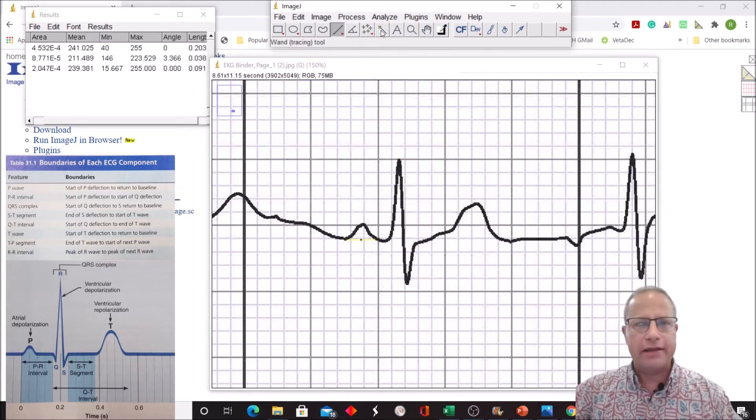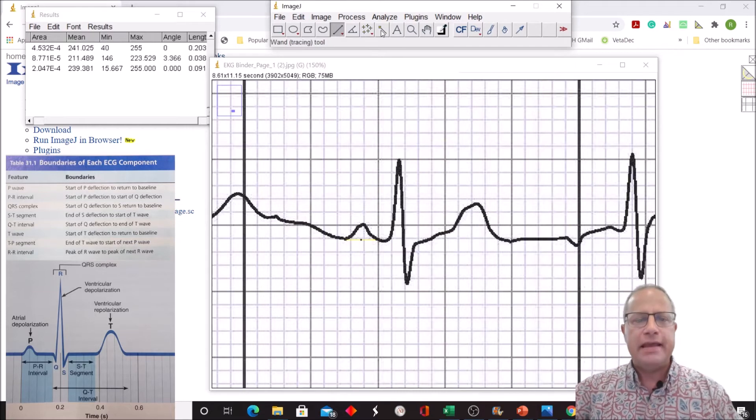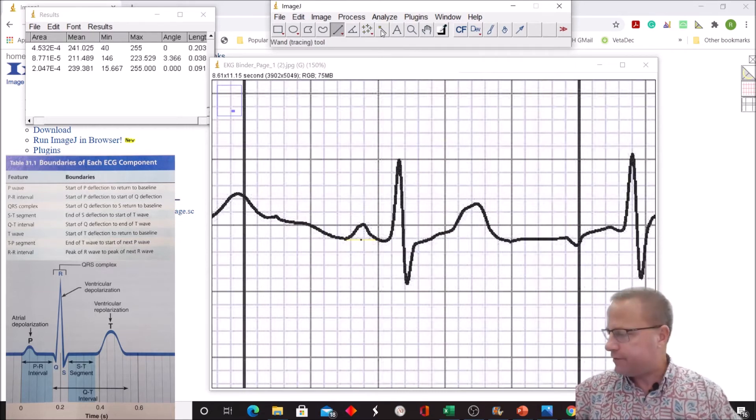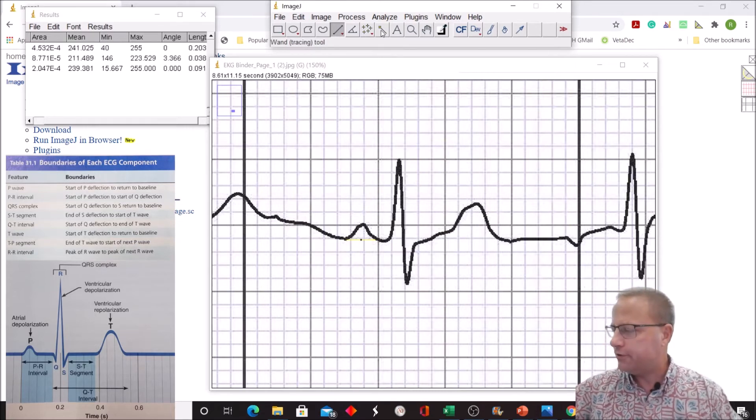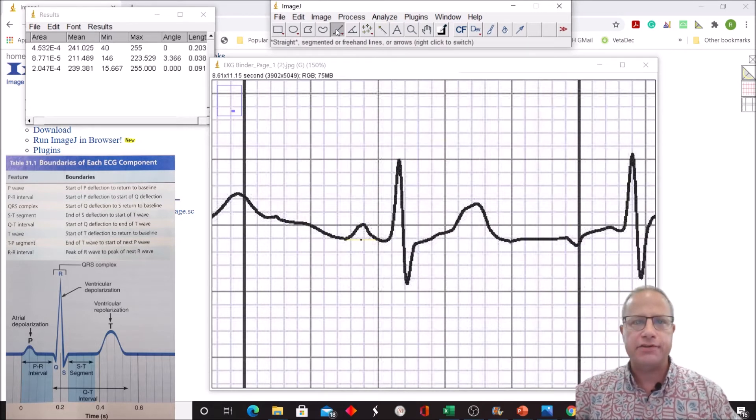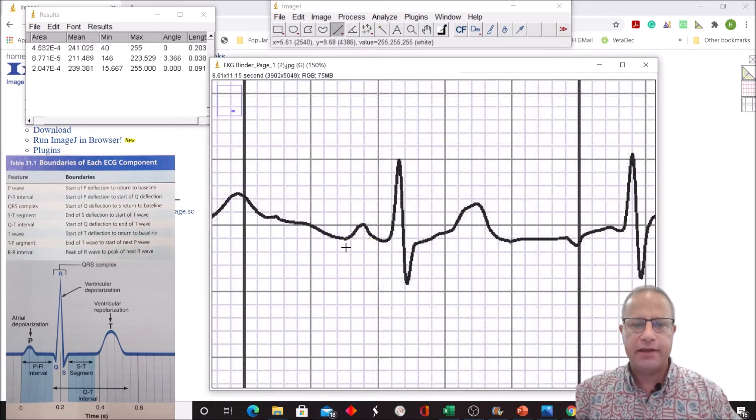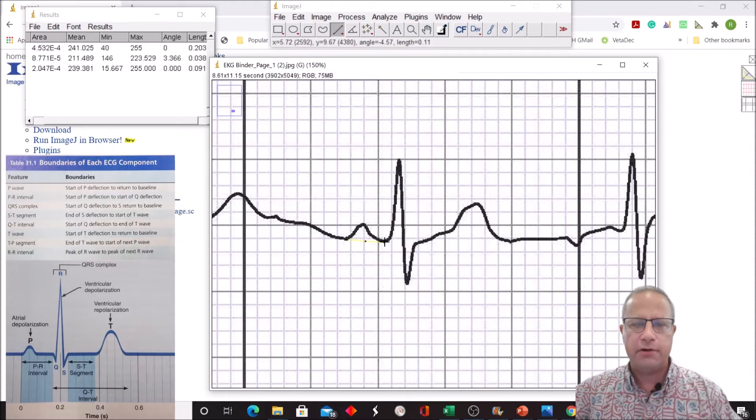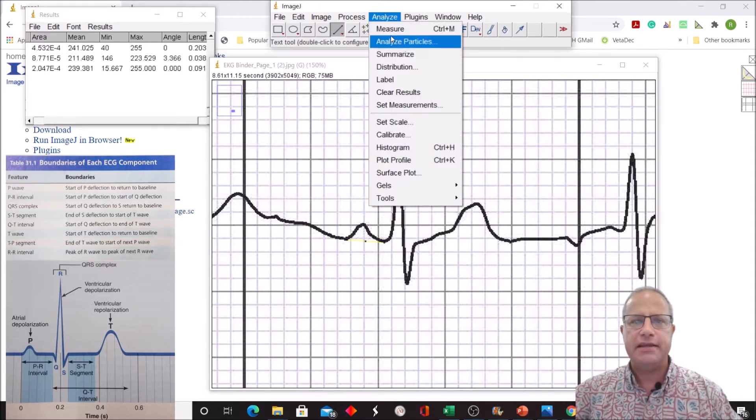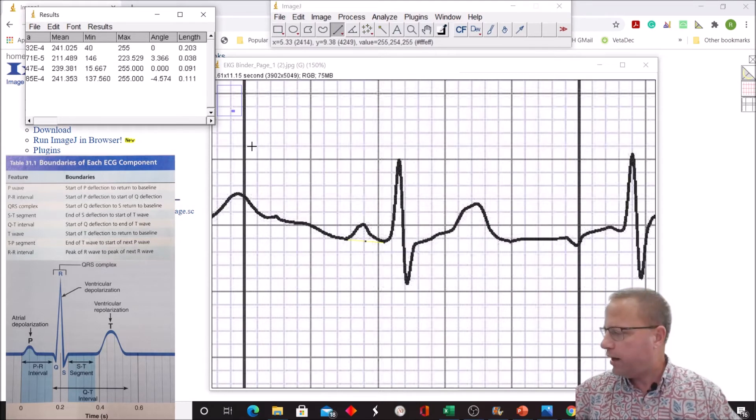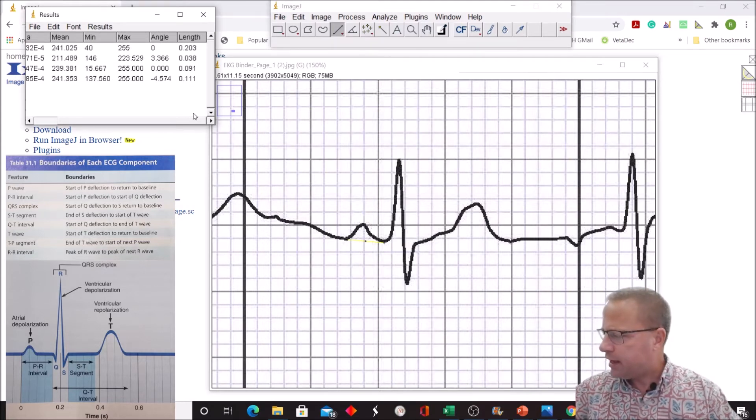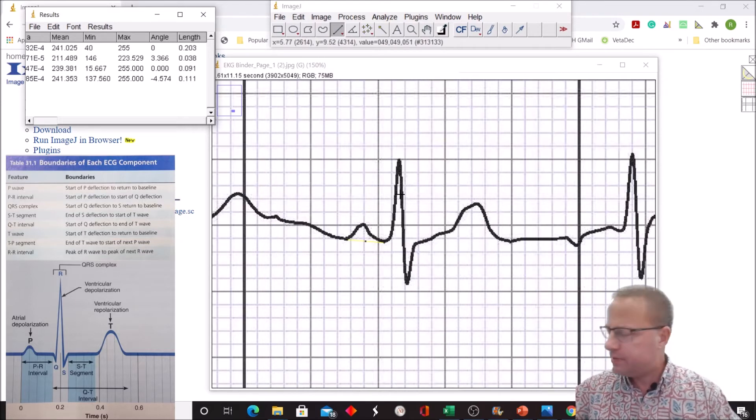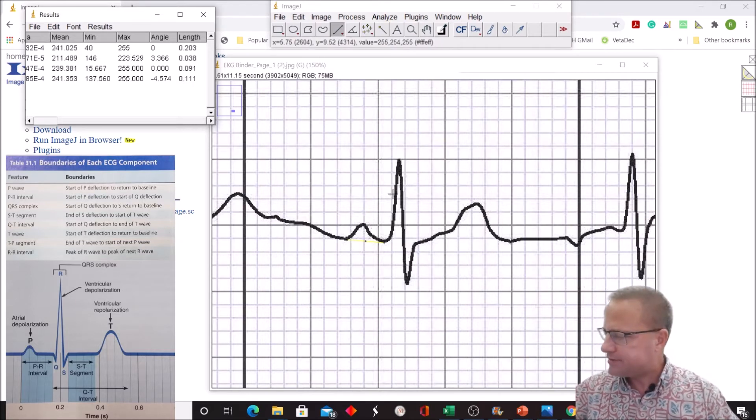Now we're going to measure the P-R interval. The intervals contain a wave. The P-R interval is start of P-deflection to start of Q-deflection, so it contains the P-wave but not the Q-wave. Start of P to start of Q, probably right about there. We don't see the downward part of Q, so we're just estimating. Analyze, measure, and that comes out to be 0.11 seconds. It should be somewhere between 0.12 to 0.20, so that might be a little bit on the shy side.